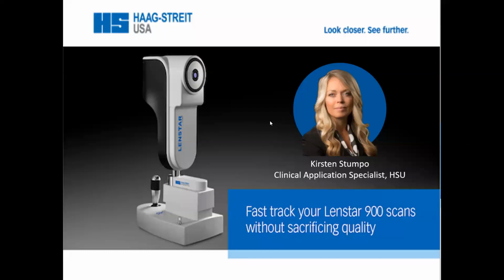During tonight's webinar, I'm going to share with you some tricks and tips on how to take faster scans with the Lenstar. Some of the material I'm going to go over is going to go kind of fast, but we are talking about faster scans. So if you feel like you might need more training at a slower pace, I will be posting a link at the end of this presentation to help you sign up for additional training. Also, feel free to use the chat section to ask any questions you have as we go.